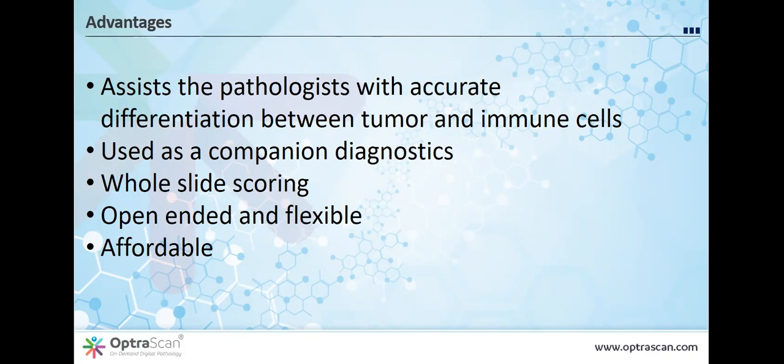There are issues regarding the intensity of the staining that you develop, and if you don't have really good control over your immunohistochemical staining process, including the hematoxylin component, then the algorithm can misinterpret some of the cells. So again, this can be tuned, but it does mean that the pathologist and the lab must pay serious attention to the quality of the immunohistochemical stain.